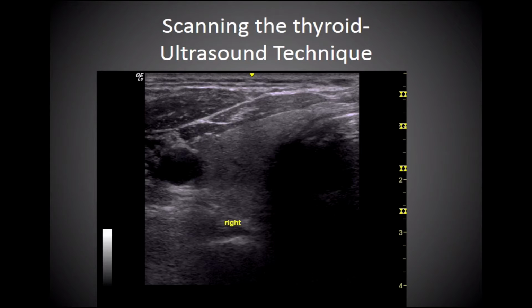How about some pitfalls in normal thyroid? Well, the normal thyroid has a fine, homogeneous echo texture that is more echogenic than the adjacent muscles. In the periphery of the thyroid lies the carotid artery and internal jugular vein, marking the edge of the normal thyroid. In older patients, small, insignificant echolucent accumulations of colloid material are commonly seen. The thyroid capsule is a thin, echogenic line surrounding the gland. Color flow Doppler imaging of the normal thyroid demonstrates minimal flow signal, which is usually located near the poles of the gland.